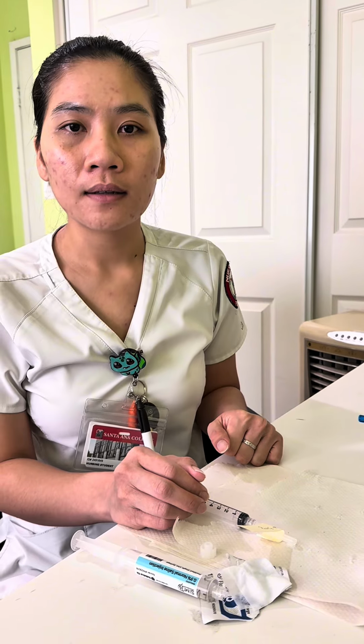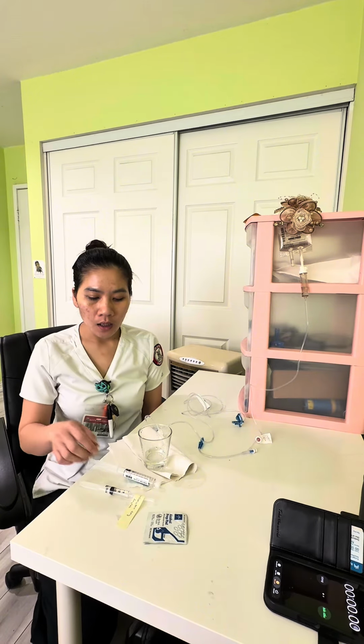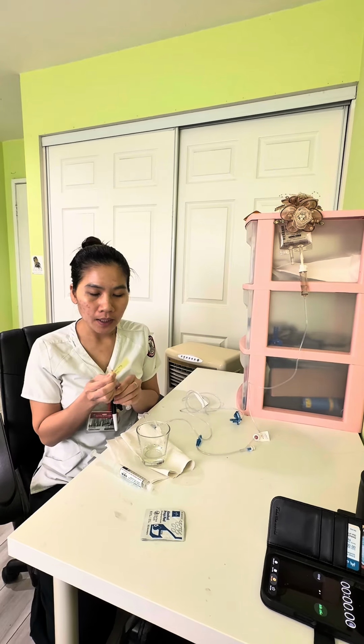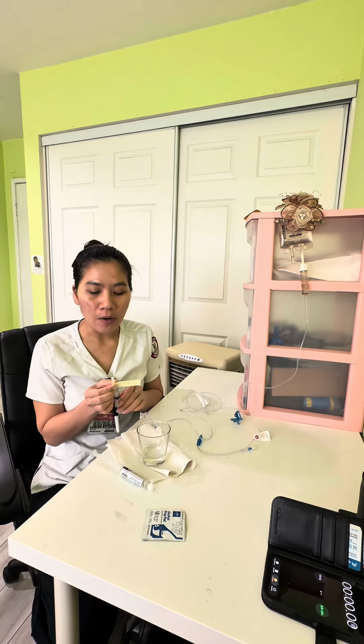So right now I'm going to perform the IV push with the running compatible solution. The medication I'm using is ondansetron, 4 milligrams. And the running solution is normal saline with TKO, 10 milliliters per hour.